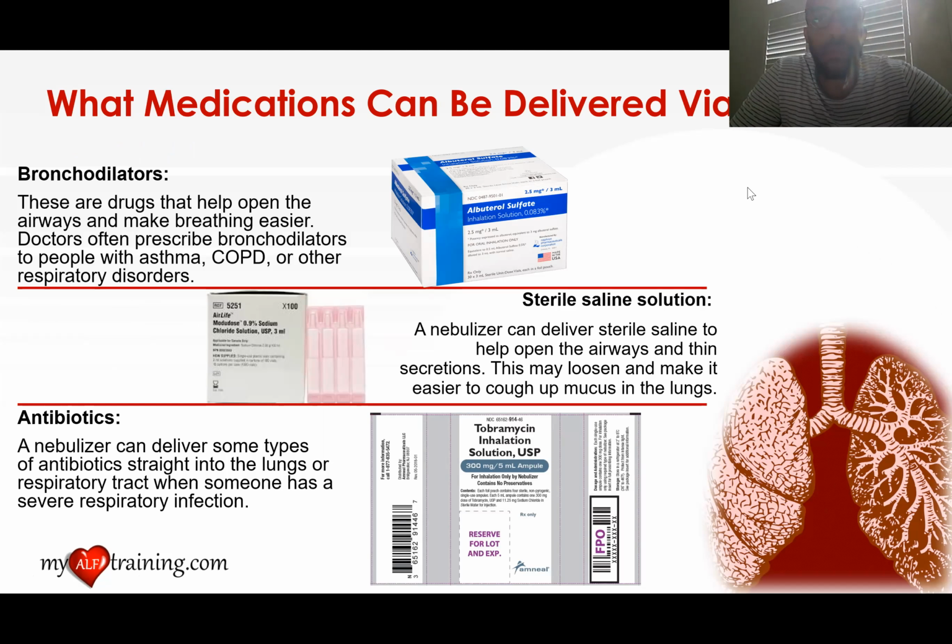So the medications that can be delivered through a nebulizer treatment would be bronchodilators. And bronchodilators are drugs that help to keep the airways open. They help make breathing easier for the patient. And doctors use these medications very commonly.